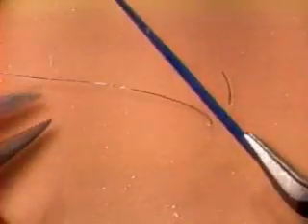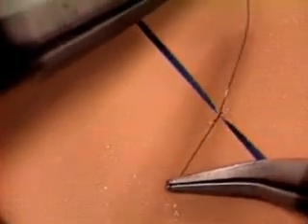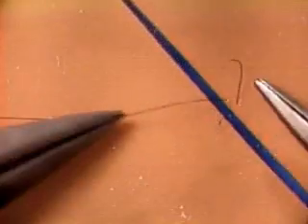Well, it seems it took a long time to talk about making one half knot, but I hope you'll find it easy. Let's look at the sequence one more time. 1, 2, 3, 4. When you've practiced it for a while, it'll go just like this.